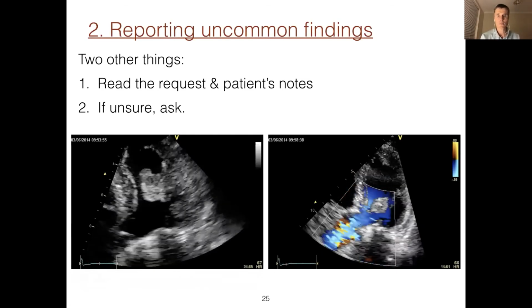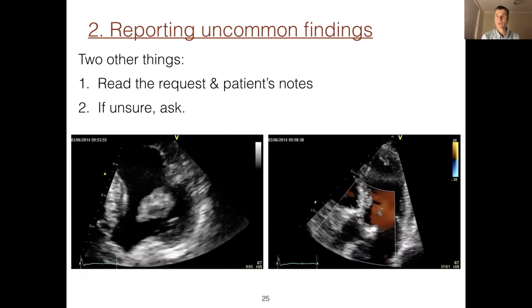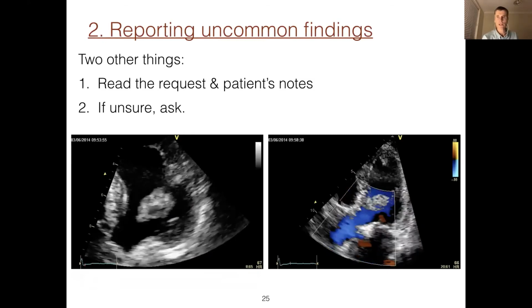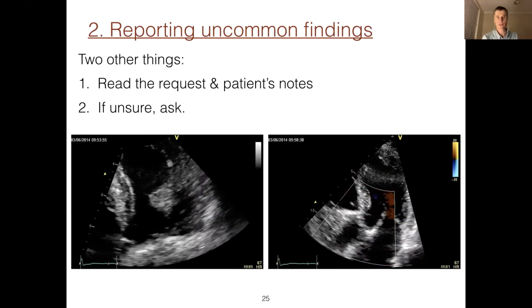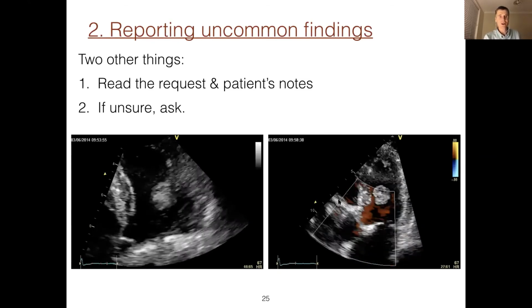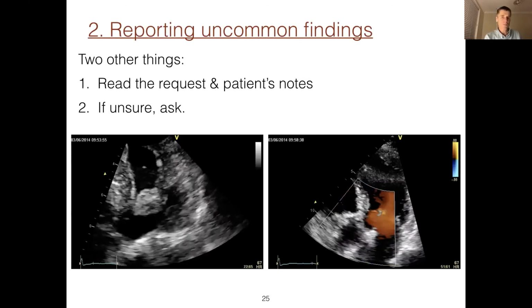As a matter of fact, these images are quite old, and in subsequent years, 5 years later, this patient continues to return to a clinical practice and has that particular lesion, which is a papillary fibroelastoma, in exactly the same location, and causing similar anxiety for the sonographers, but really no problems for the patient.